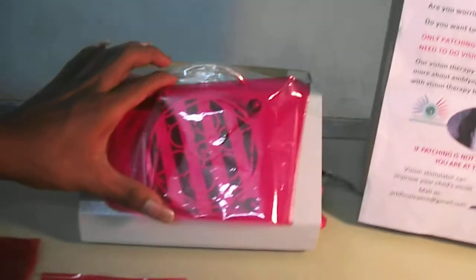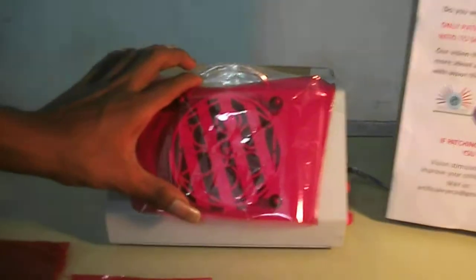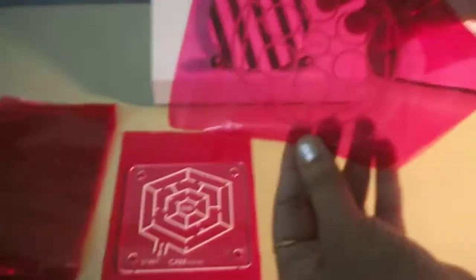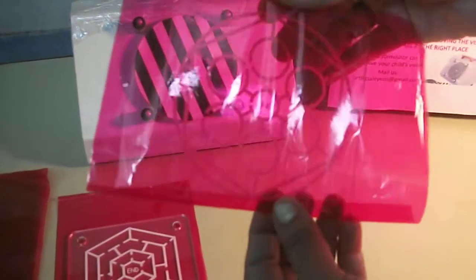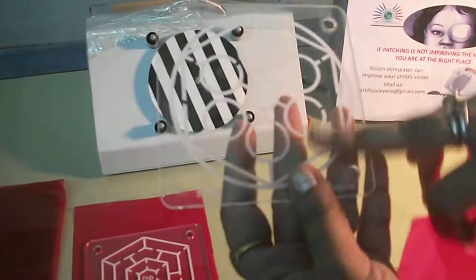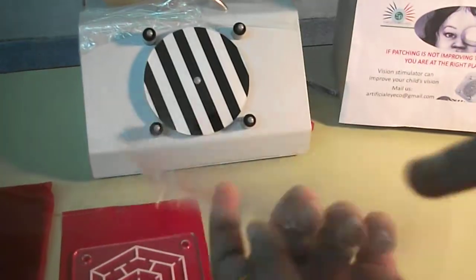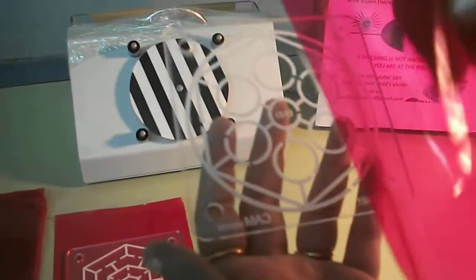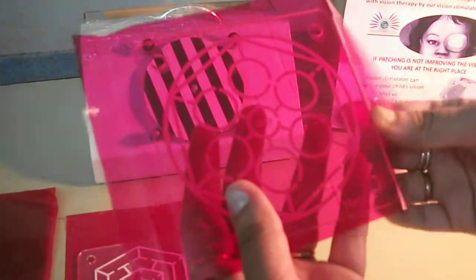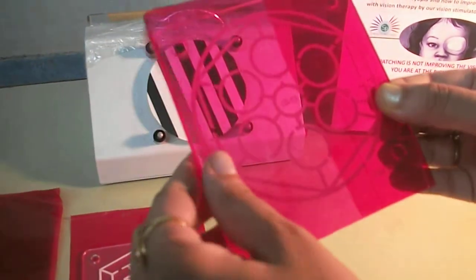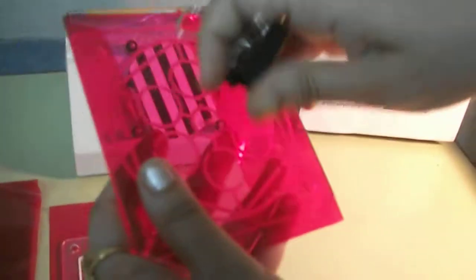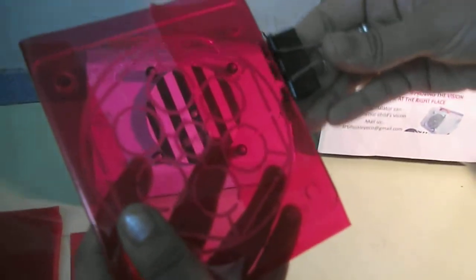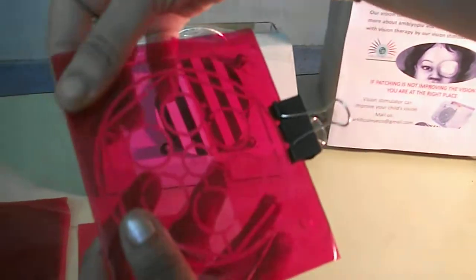Now we will see that. So here is the desk on which there is a smooth surface and a rough surface. Keep the smooth surface above, and now put the cellophane paper like this. With the help of a clip, you are going to fix this paper.